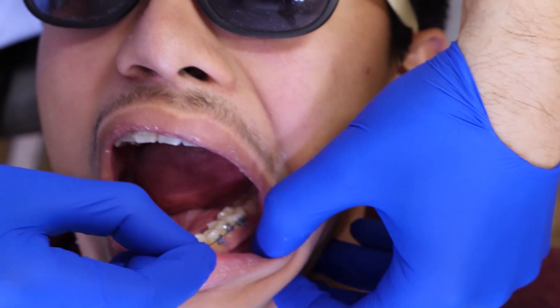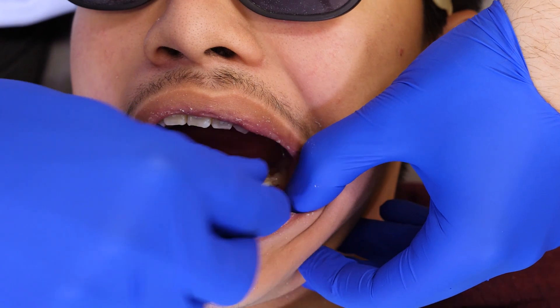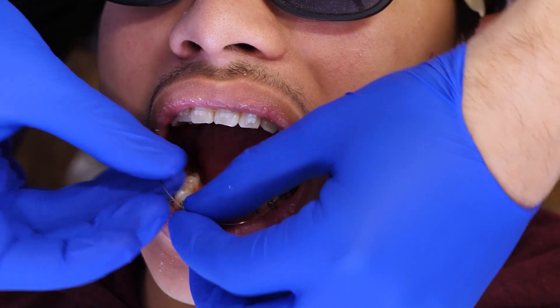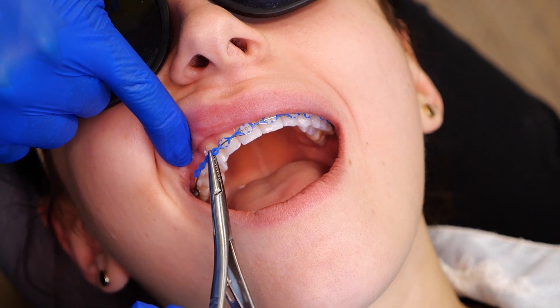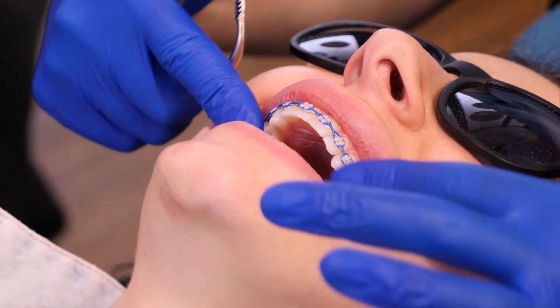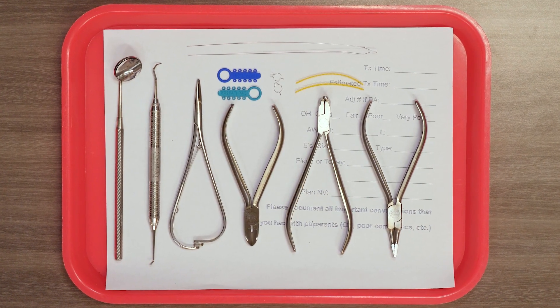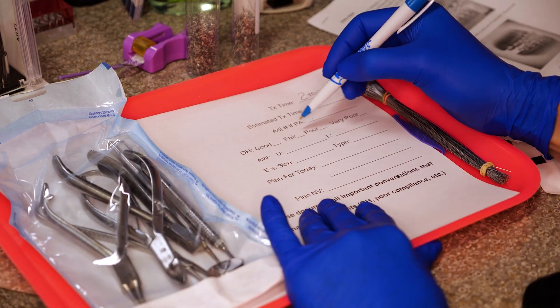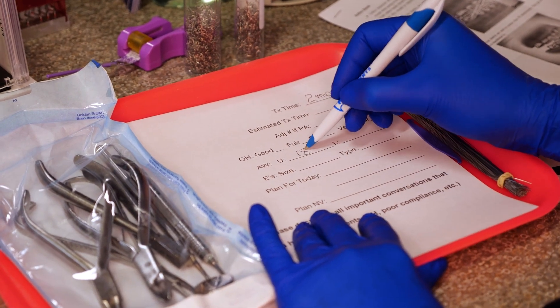Smaller sizes, like 0.014 inches, are often used to initiate treatment and for fine adjustments. On the other hand, larger sizes, like 0.025 inches, are utilized in later stages when more force is needed to shift teeth with greater resistance. During your adjustment appointment, your orthodontist will determine what wire size is best for your current stage of treatment.